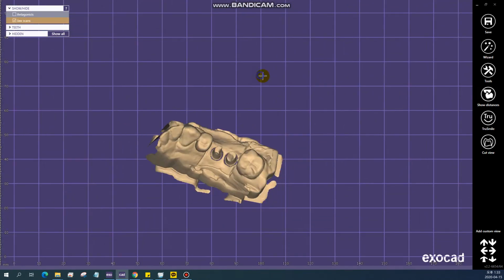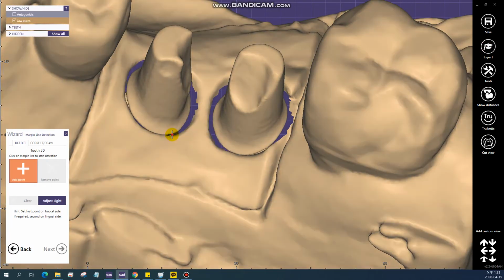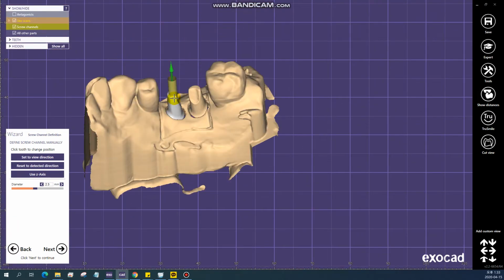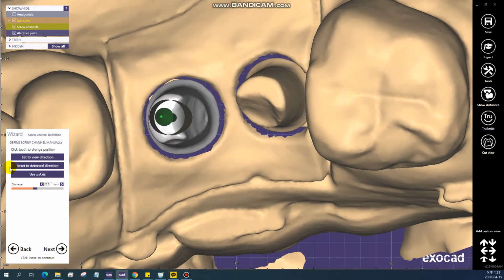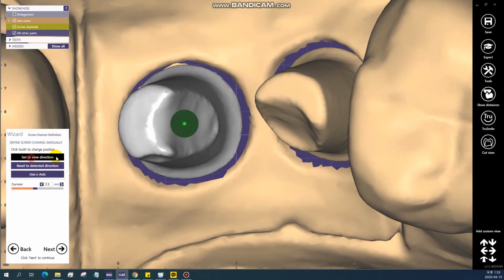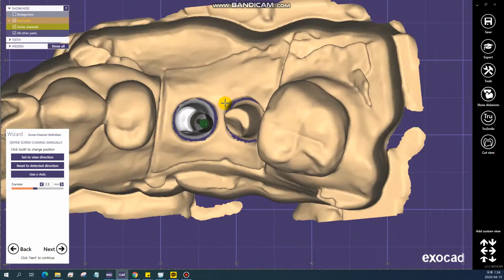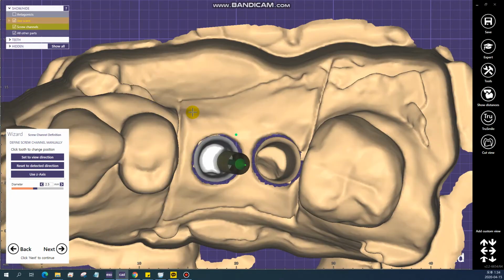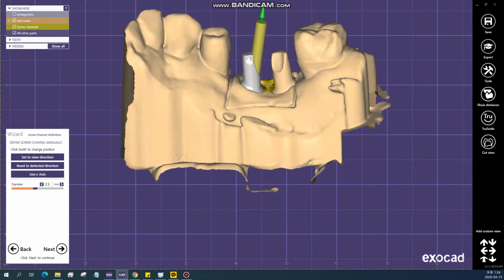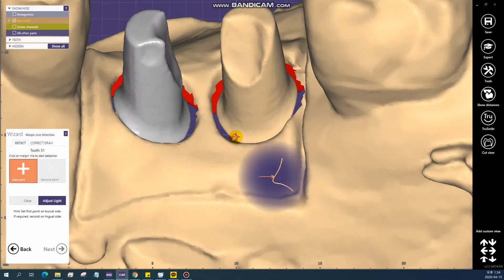And okay, I'm going to go a little faster. Then number 30 first, number 30 first, and next. And look at the angles. Now you know why we changed to one single unit for this case. The space is not that small, I mean not that narrow, for making two crowns. But look at the angles. That is why we recommended the doctor change it to one crown.